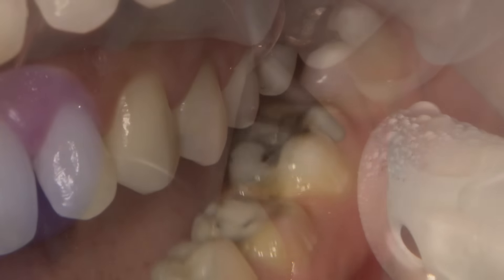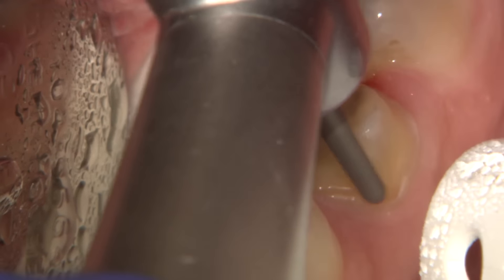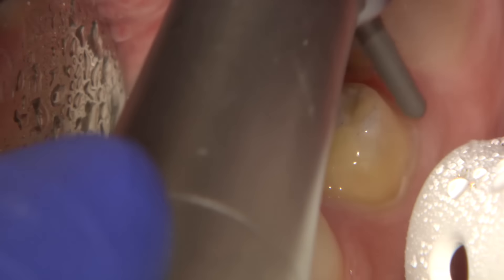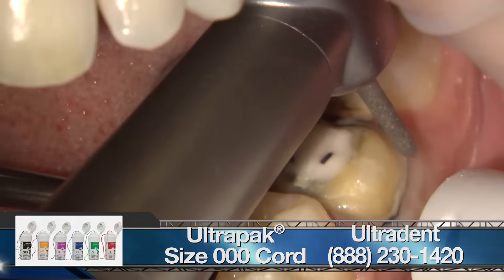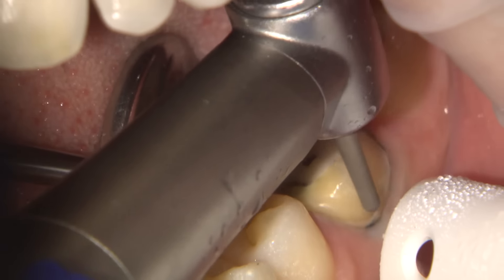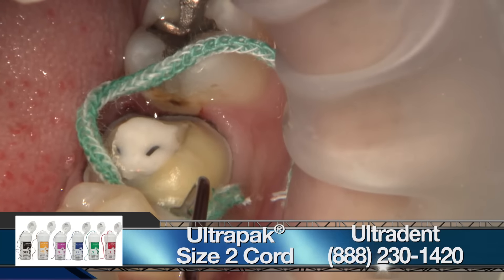Once the occlusal is completed, I begin refining the axial surfaces with a round-ended tapered diamond. The patient also expressed displeasure in how the buccal finish line was visible on the previous crown, so I moved the new margin position a bit more apically after the placement of the first cord, which in this case I used a triple zero. The first cord helps to displace the tissue more apically, while also aiding in moisture control.